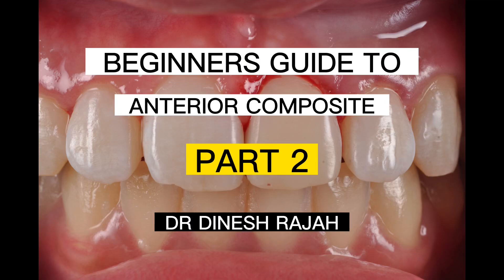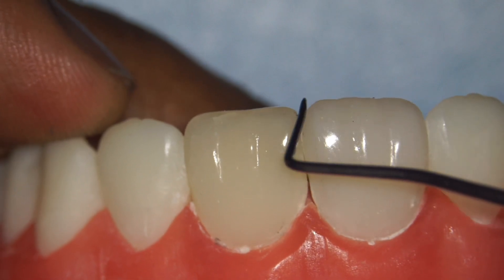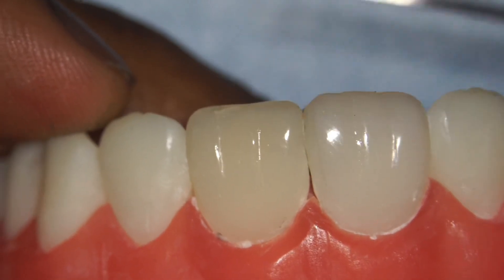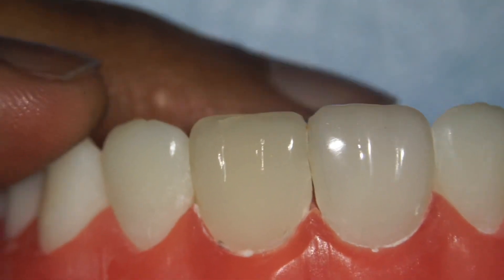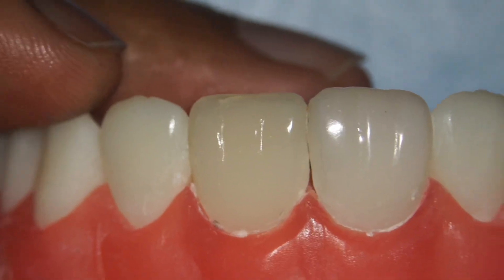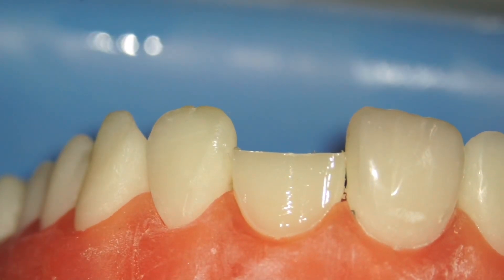Welcome back to Part 2 of the Beginner's Guide to Anterior Composite. In this video we'll be looking at how to build the palatal wall, the distal and mesial walls, and how to fill up the whole tooth. We'll start off from where we left off in Part 1, after applying the bonding agent.